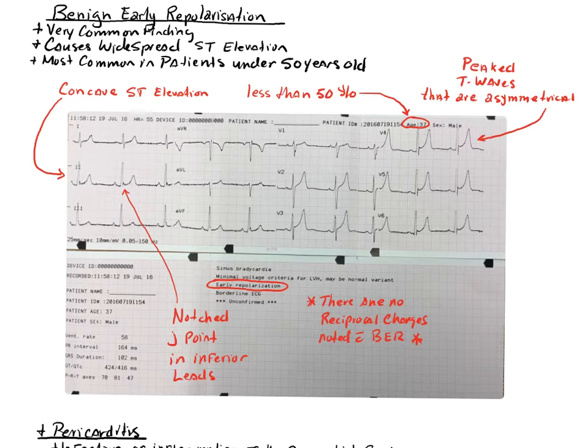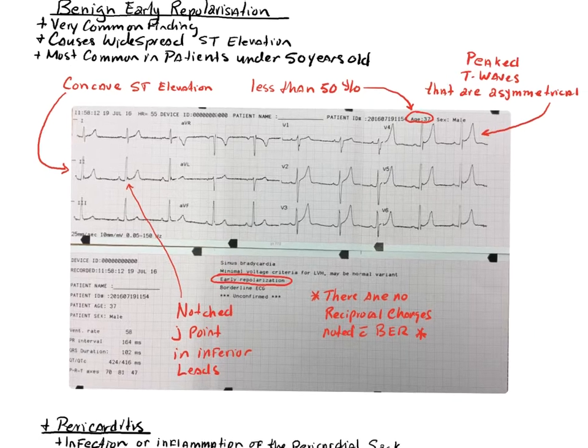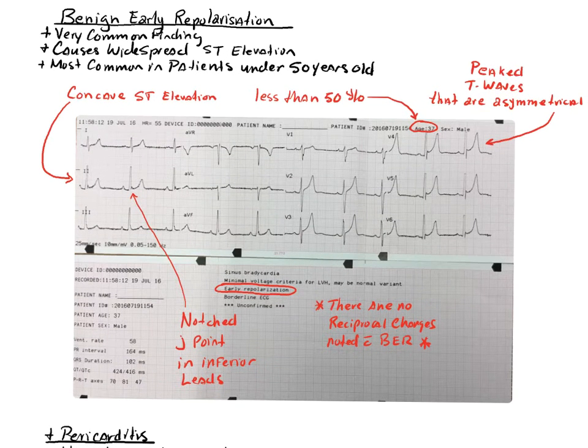Okay, so now what I want to do is start talking about things that can mimic ST segment elevation myocardial infarction, or STEMI. One of the most common mimics of STEMI is known as benign early repolarization. Very common finding.